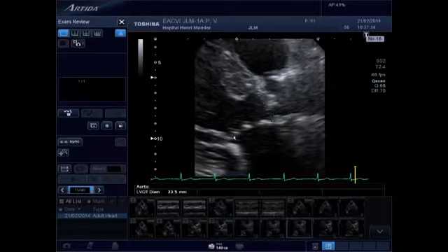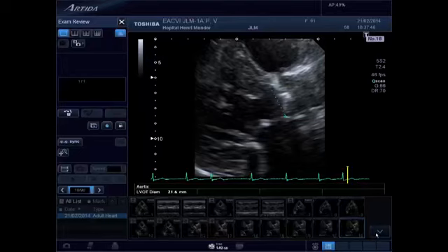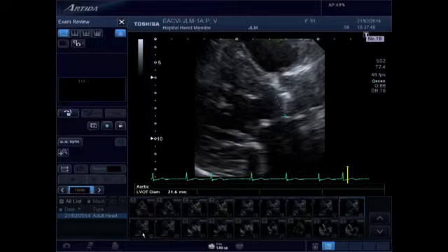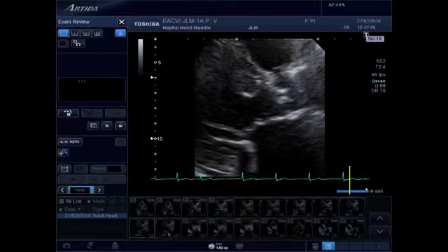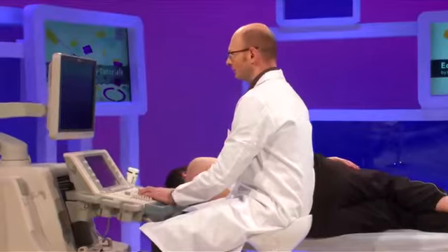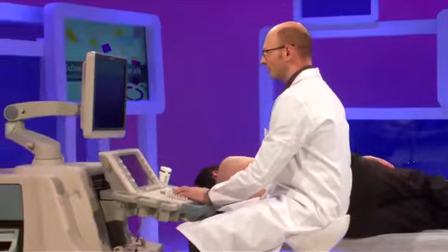Here we have one first measurement at 24 millimeters, a second measurement around 22. We cannot overestimate this measurement by echo. Clearly, this is rather underestimated as compared to CT scan, and we will finally take the value of 23 millimeters for this virtual basal ring diameter, which will be used for the calculation of the aortic valve area by the continuity equation.